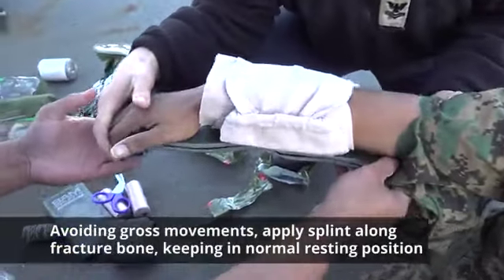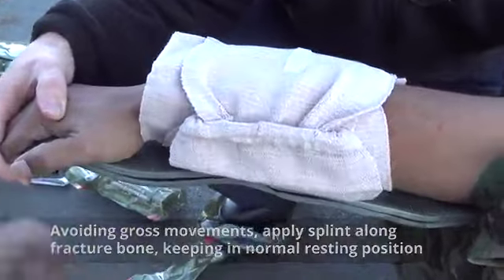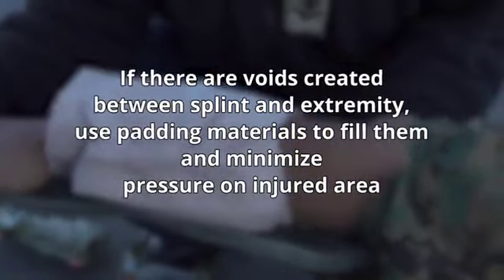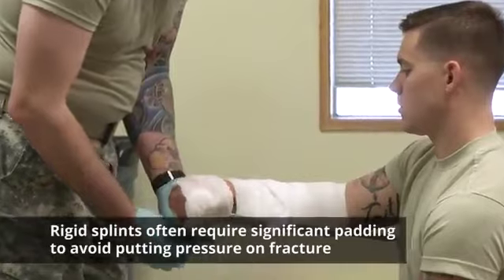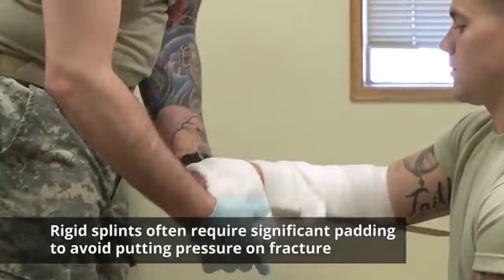Avoiding gross movements, apply the splint along the fractured bone, keeping it in a normal resting position. If there are voids created between the splint and the extremity, use padding materials to fill them and minimize the pressure on the injured area. This is particularly true for rigid splints, which often require significant padding to avoid putting pressure on the fracture.